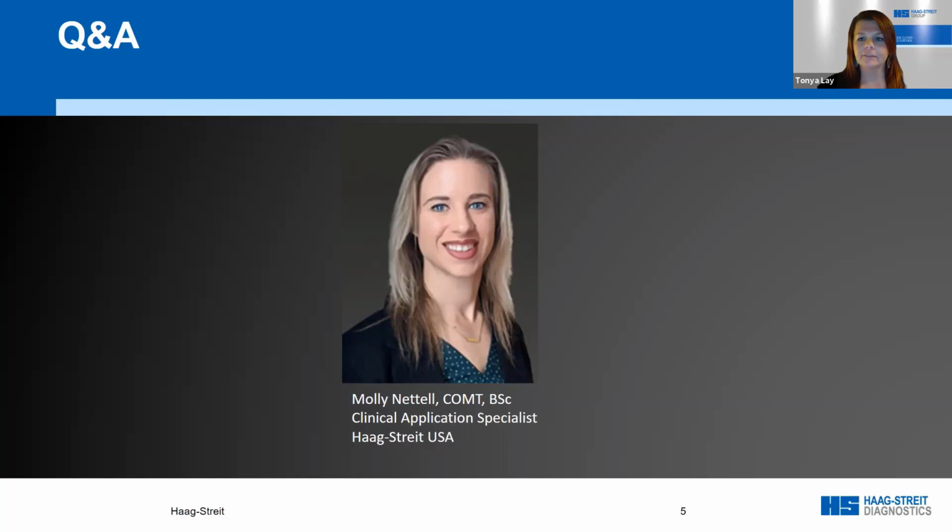Excellent. The next question here is, can an Octopus 600 run a ptosis or driver's license screening? Great question. I get this a lot, and the answer is no. The Octopus 600 is a 30-degree field. It is a static perimeter only, and as we talked about, kinetic perimetry works best for ptosis and driver's license, and you also need a full field perimeter. So the Octopus 900 would be the best option for that.